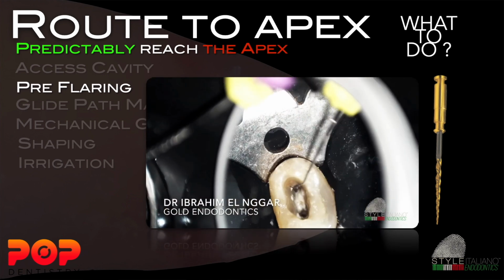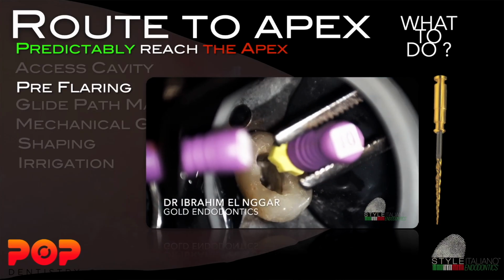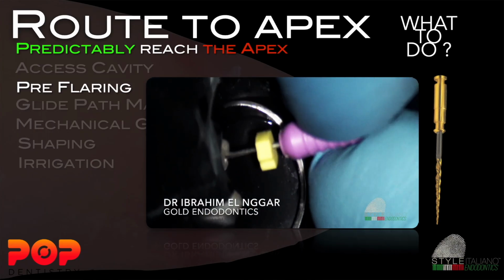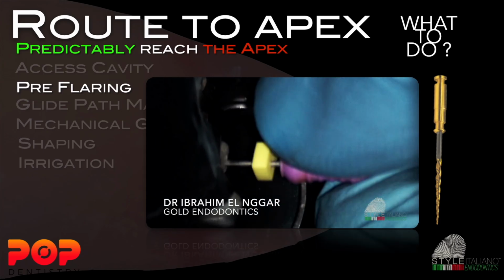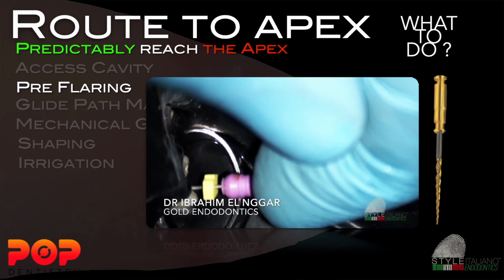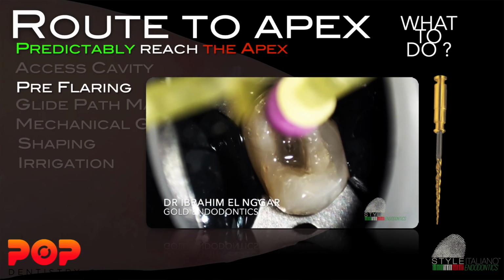You can see I'm just holding the manual file. Here I'm doing a manual glide path. We will discuss it in the next slides. The file is progressing easily, but in the other canal, which was wide, and after pre-flaring became even wider, the file went without any use of a manual glide path.